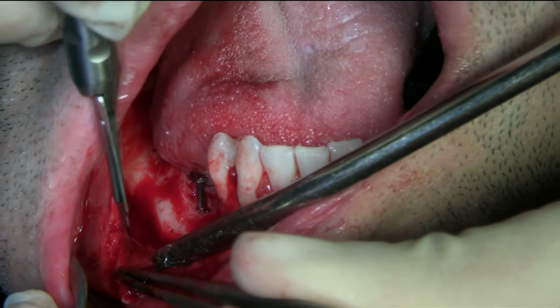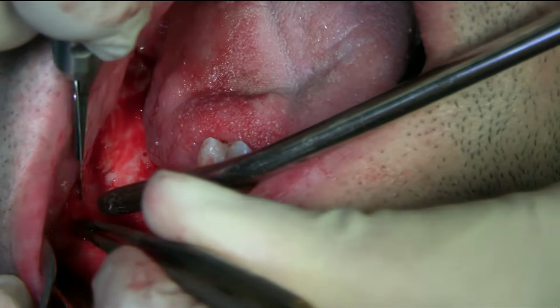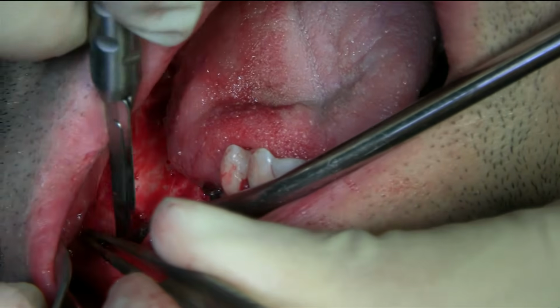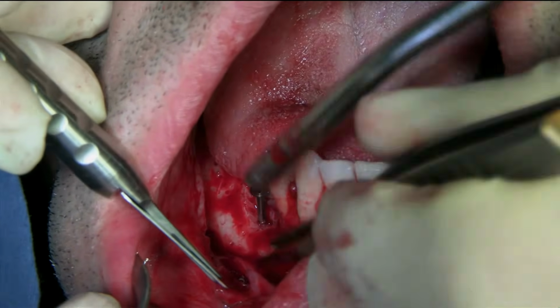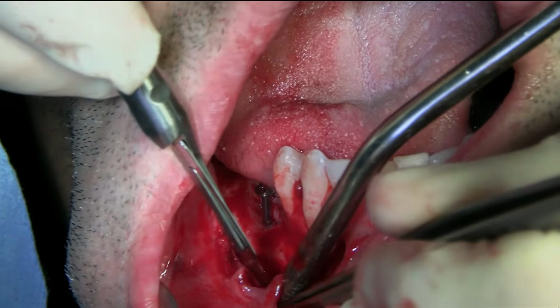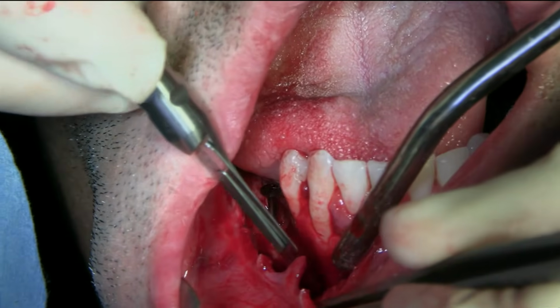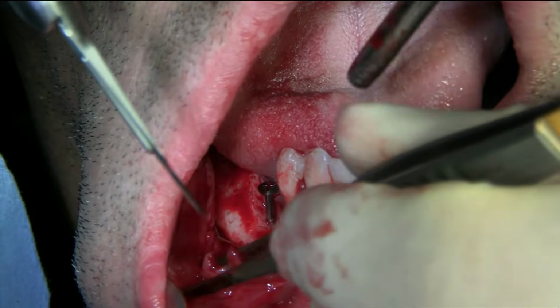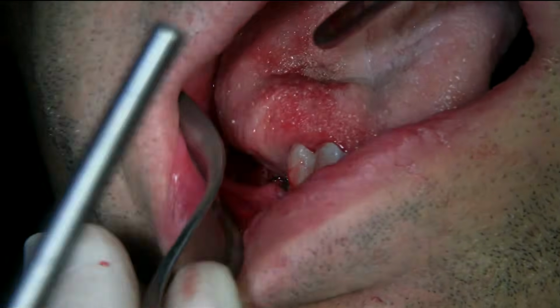Section there. Okay, sorry. Okay, let's go to the posterior. Looking pretty good.